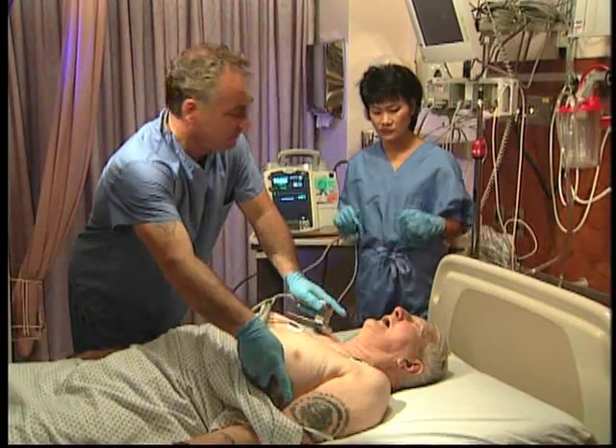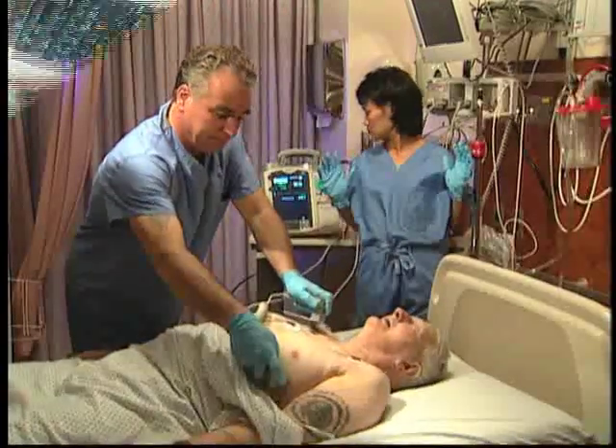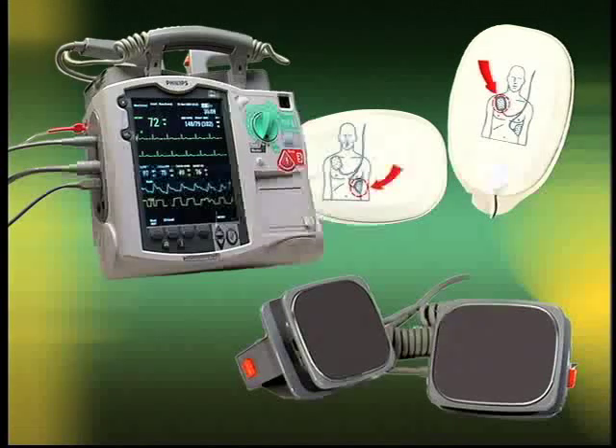With manual defibrillation, you control the defibrillation process. The HeartStart MRx lets you perform manual defibrillation using multifunction electrode pads or external paddles. Here we'll demonstrate manual defibrillation using external paddles.